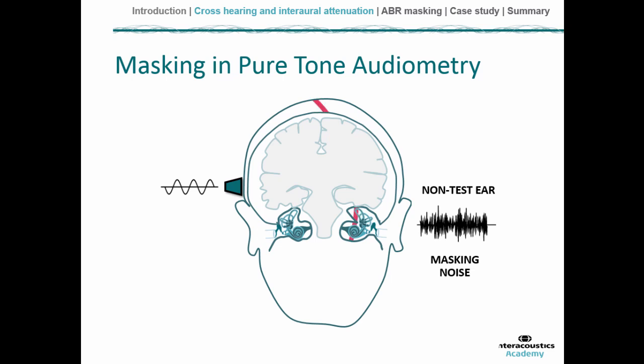And we would do the same thing, slightly different procedures of course, but in principle the same thing, whether or not it was bone conducted or air conducted sound, such as here with the supraaural, or here with the insert phone.